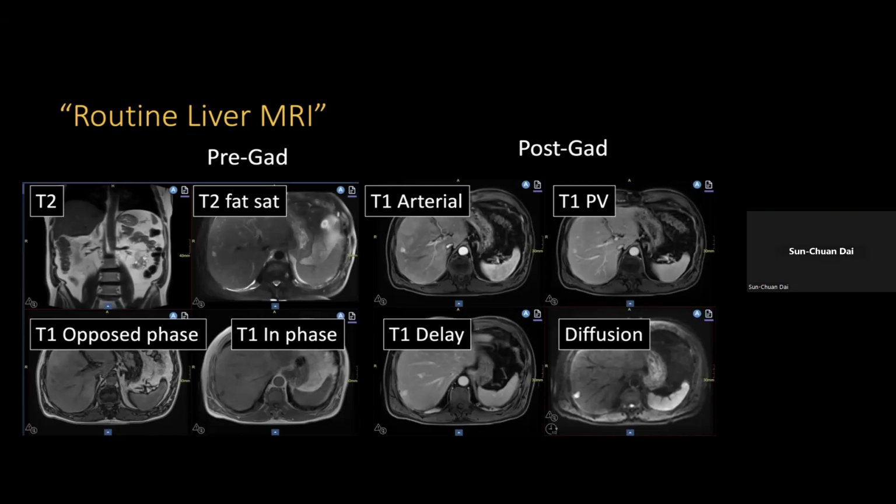Mike, yeah, quick question. I've been told that a CT with pancreas protocol is about 4 times the amount of radiation as a regular CT. Is that accurate? It depends how you do it. The radiation goes with the number of phases that you do. Standard pancreas protocol has you acquire 3 images: a non-contrast image, what we call a pancreas phase image, and a regular portal venous phase.